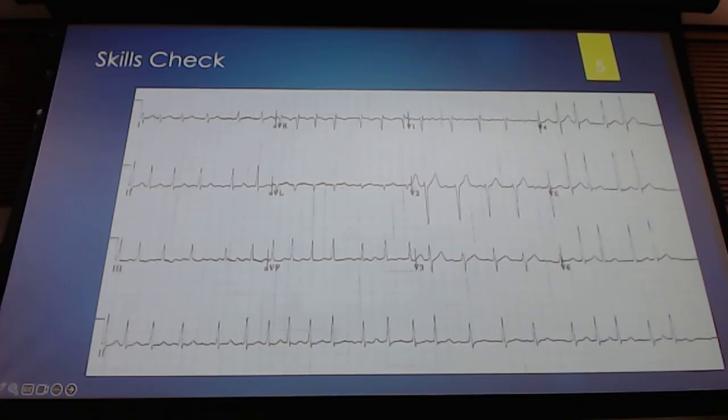So again, when we look at this narrow, irregular tachycardia, we're not going to think about what causes regular tachycardia. We're not going to think about what causes wide tachycardia because that's not part of our differential. If you can approach these ECGs and even approach the exam this way, you'll be a lot better off than trying to remember all the things that cause tachycardia, all the things that cause bradycardia. You've got to separate them into likes with likes, okay? And it'll make it a lot easier.